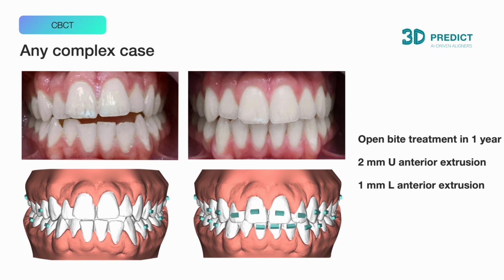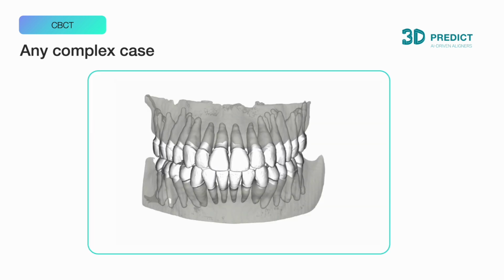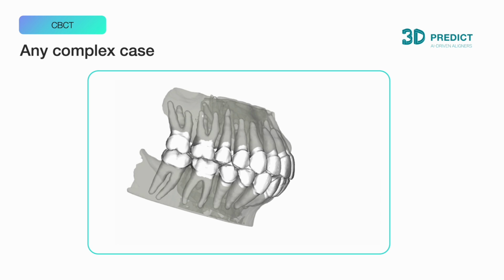Can you treat the first complex case that I showed? Absolutely. But you and your patient need to be aware of the road ahead. We have a lot of doctors that choose to treat complex cases, but always with a CBCT. Once again, you can make an informed decision based on the guidelines I presented.